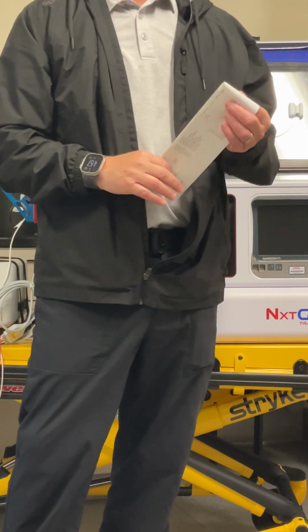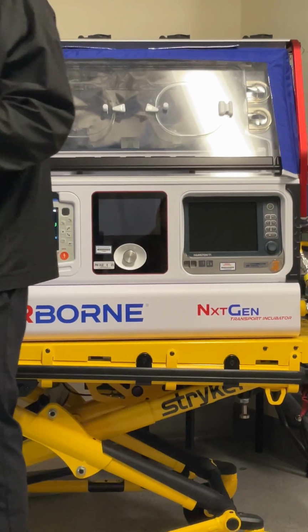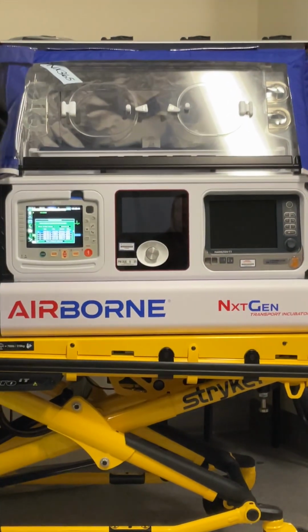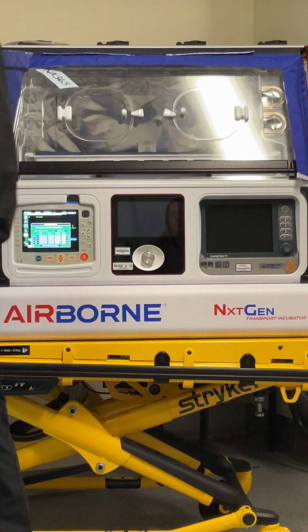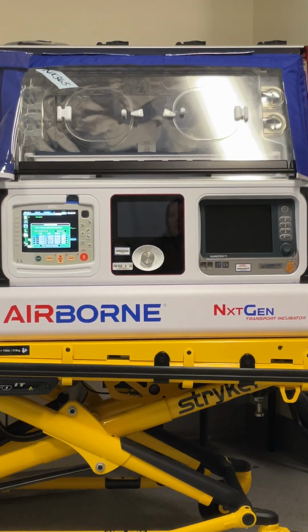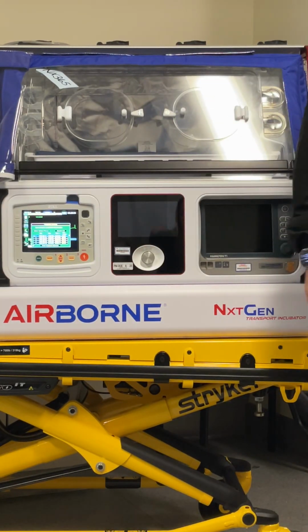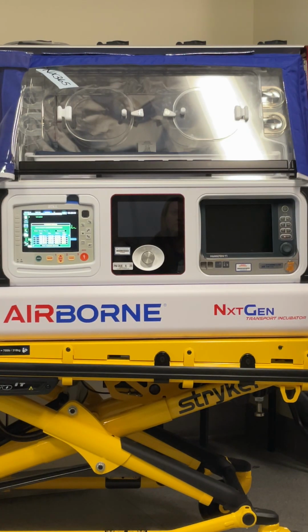Questions, concerns about that? We can print a lot of paper or not a lot of paper. And I asked, we can't just push this directly into Epic. It doesn't go directly in Epic. They don't have that button. So once you've turned it off for 2 minutes, then it just gets stored in this clipboard log and you can go back. It'll show the last, I believe, 33 calls in there.